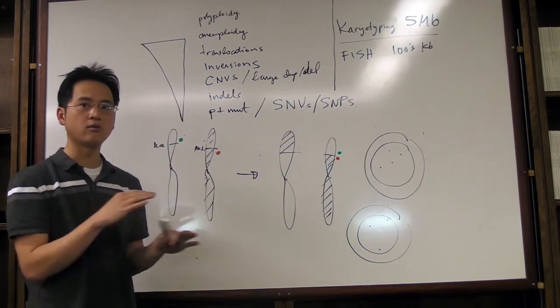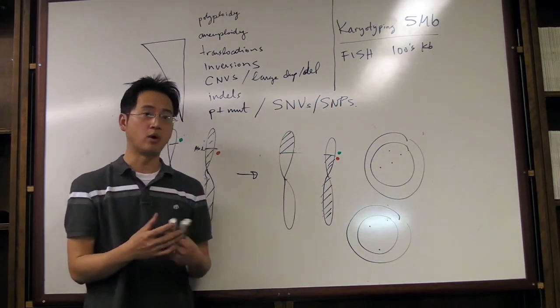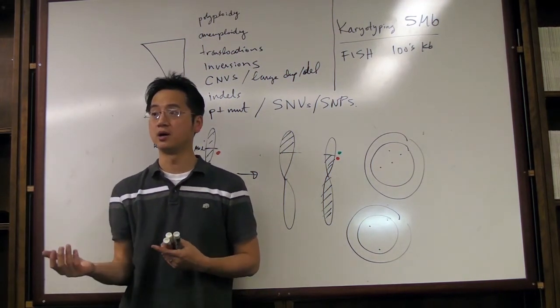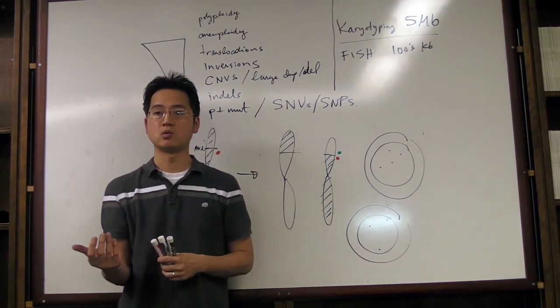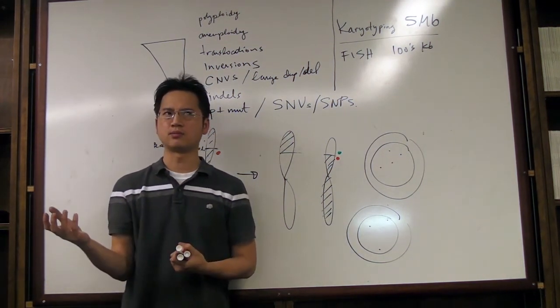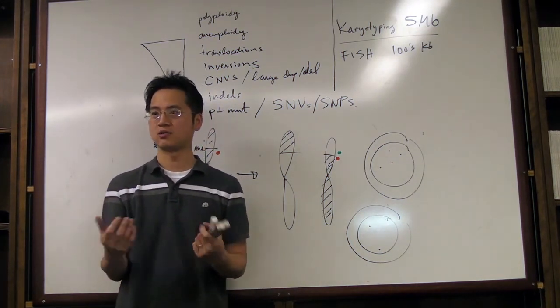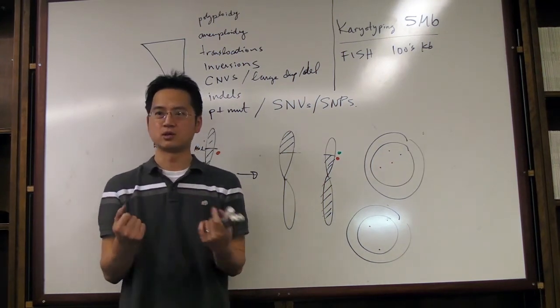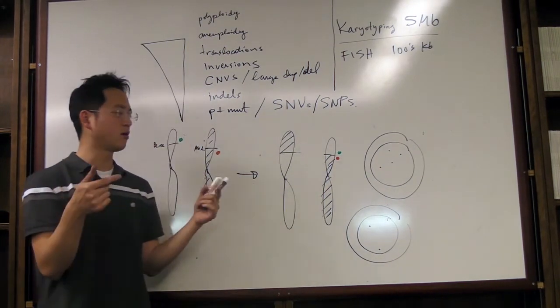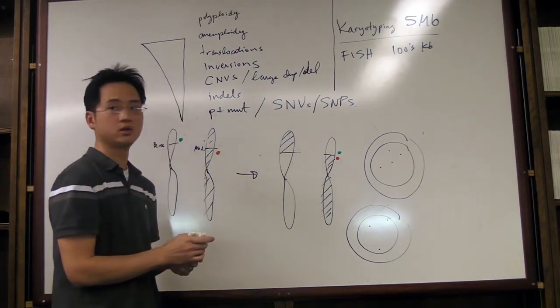And therefore, all of our FISH assays in the lab, we use break-apart probes because it's more clinically sensitive. At one point, maybe it's important to know what the partner is. So, for example, RAR alpha PML, that one will respond to retinoic acid. But there's another version, I'm blanking, I think it's the PLZF one, which does not respond to retinoic acid. So in that case, you do want to know the partner. So it's important maybe to confirm that finding with RT-PCR to confirm that, yes, it involves RAR alpha and PML. So there's just certain situations where you need that and other situations where you don't.